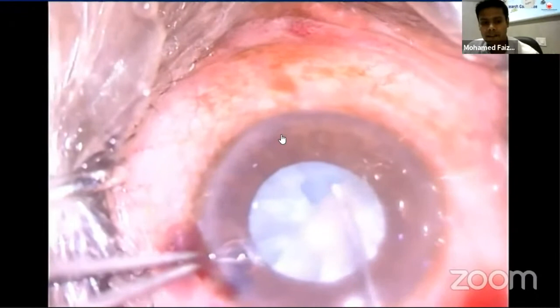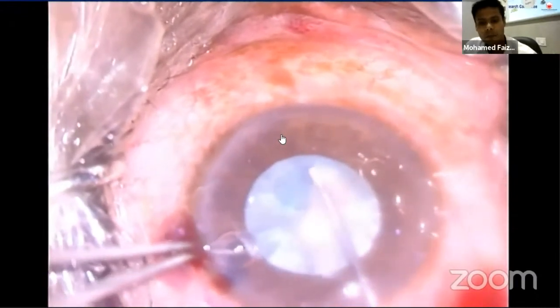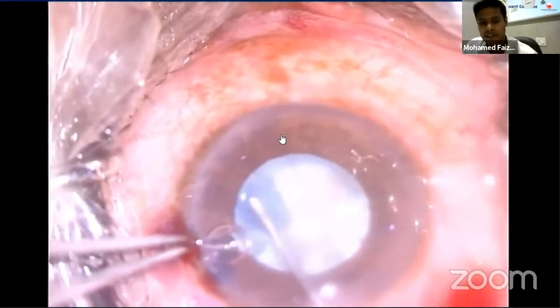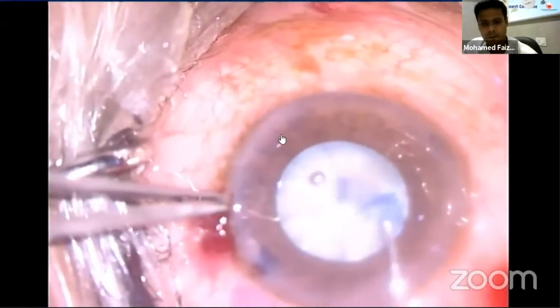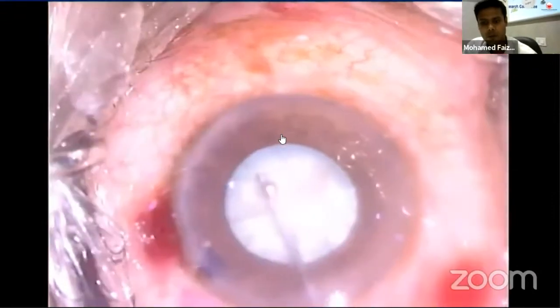The first step in successful divide and conquer lens removal is the creation of an adequate capsulorhexis. The rhexis should be no larger than 4.5 to 5.5 mm, as round as possible, and centered on the visual axis.